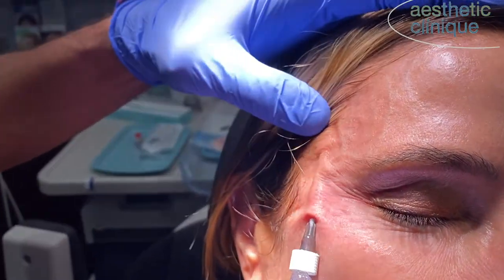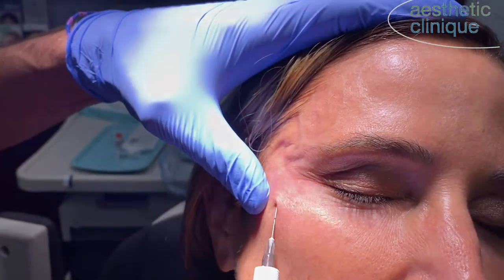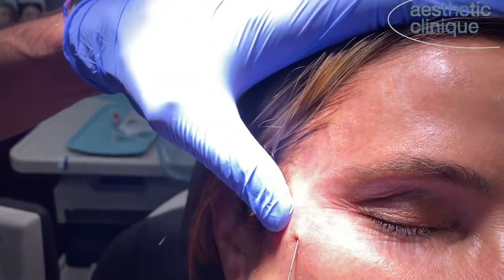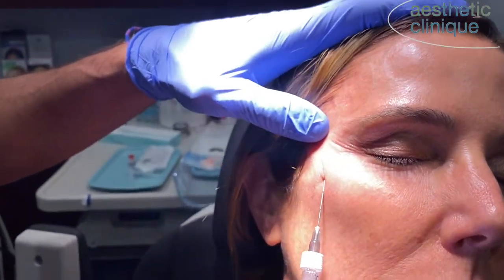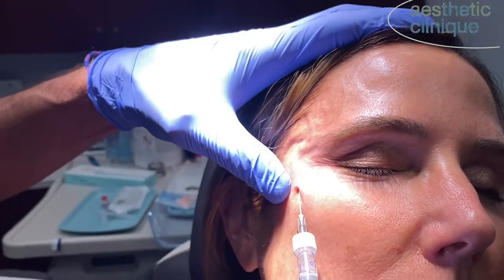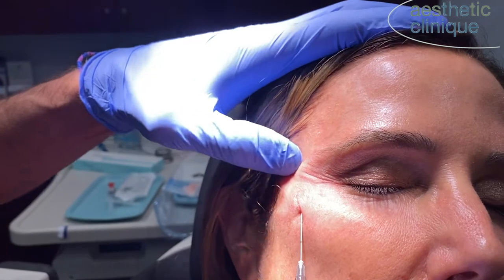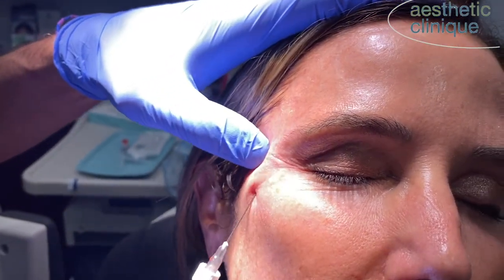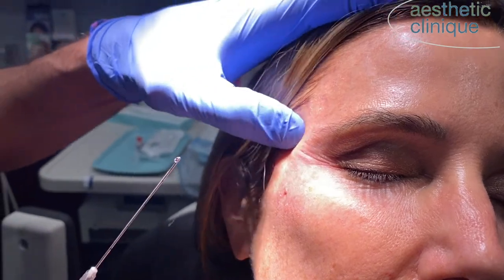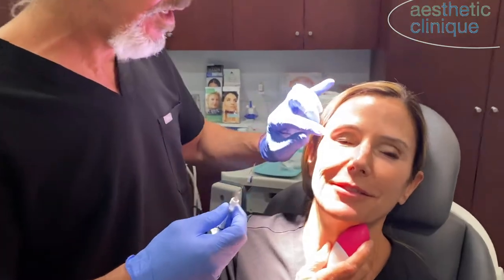Now I'm going into the hairline, constantly moving, and I'm almost done here. Behind the hairline. And if you're in that plane, you should be below the superficial temporal artery. There should be no vascular problems in that plane. I'm going to put a little bit more.